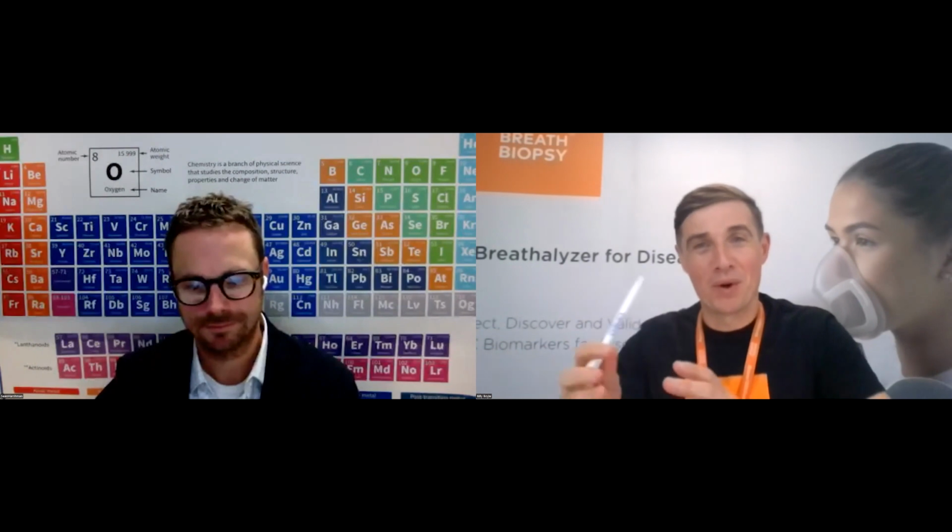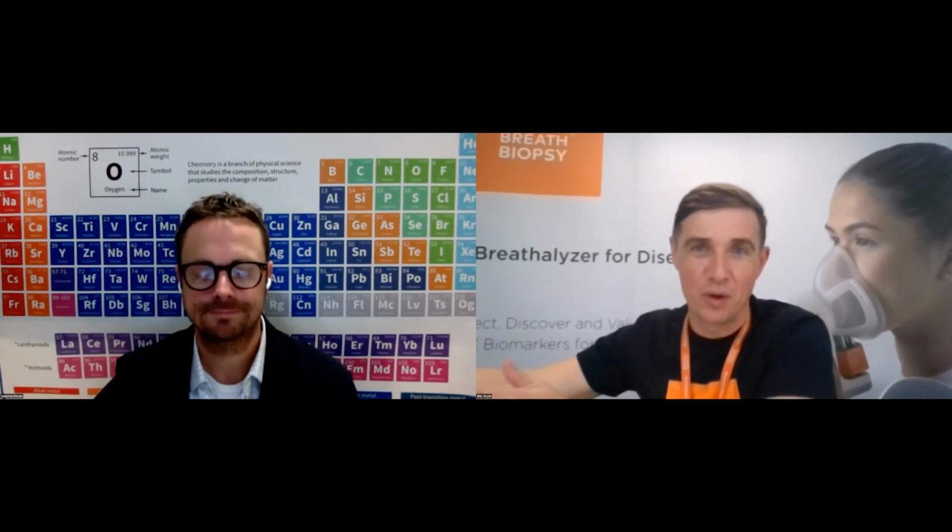So one of the things that we debate quite a lot is that in biomarker discovery, early on in a pilot, you can be a bit more permissive because stuff can fall by the wayside when you're trying to validate it. So should you have very harsh criteria to determine whether compounds are on breath at the outset, or relax that a little bit more and let validation deal with it down the line?